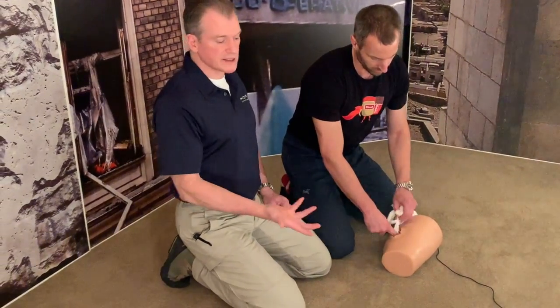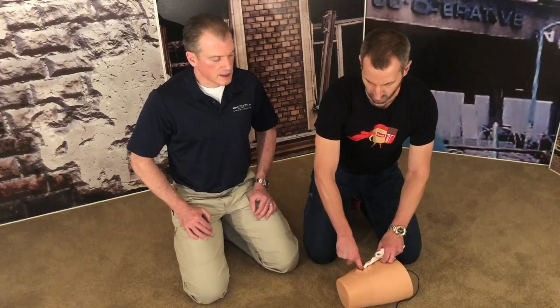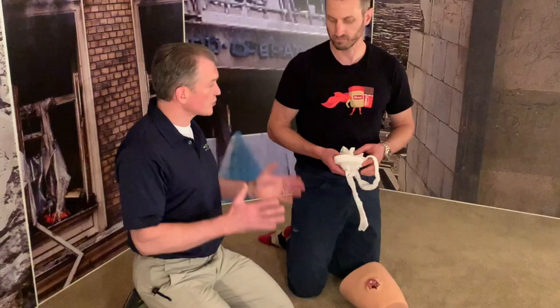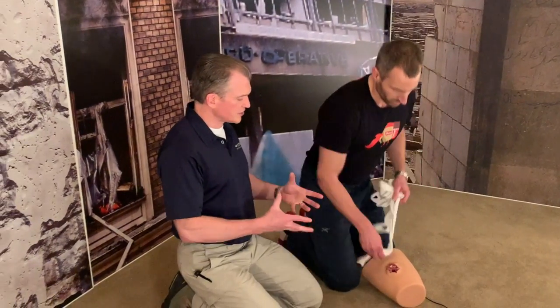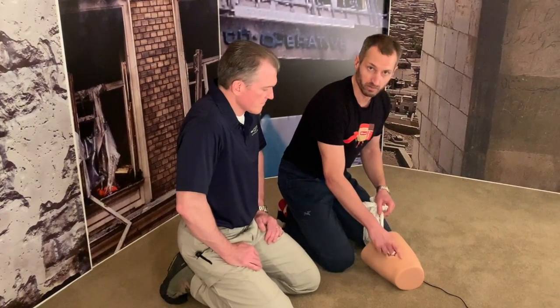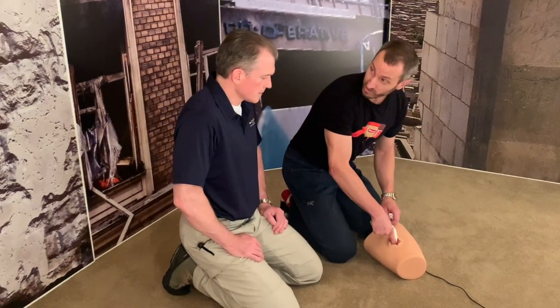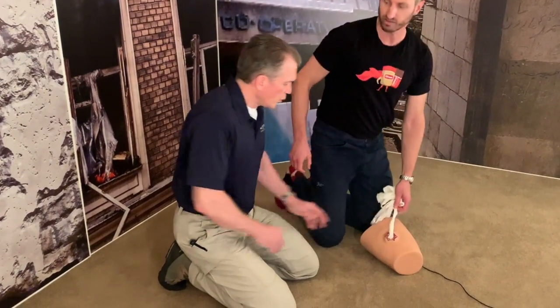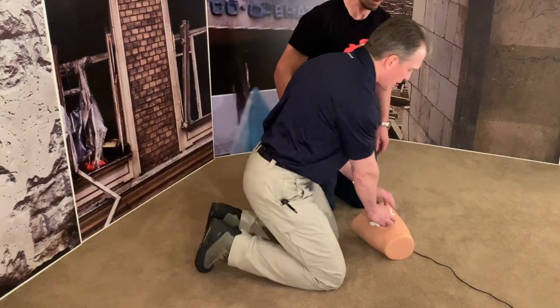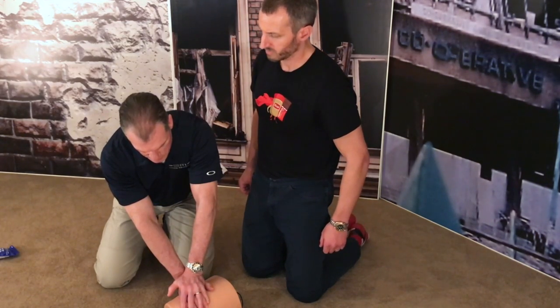The key, if you're using this kind of gauze — training combat gauze, which is a kaolin-impregnated gauze — it does require two to three minutes of direct pressure after the wound is fully packed, so the kaolin has a chance to encourage clotting. So once it's all in there, keep full pressure on it. Once it's fully packed, take whatever gauze is left over, maybe another roll of CurlX, and do two-handed pressure on it for two to three minutes.